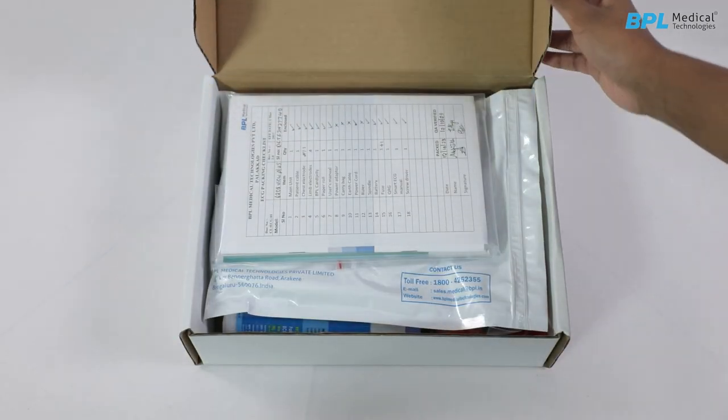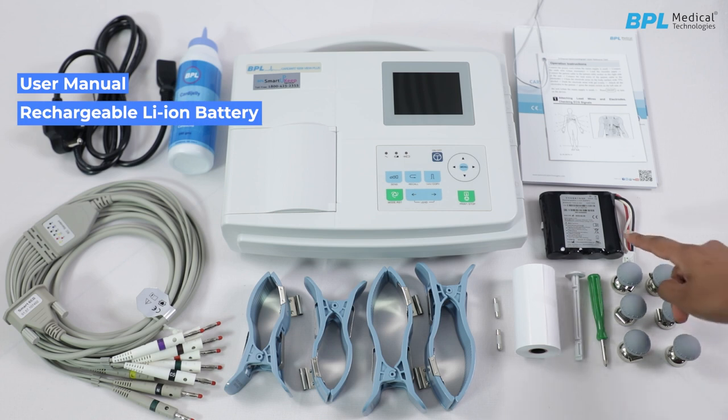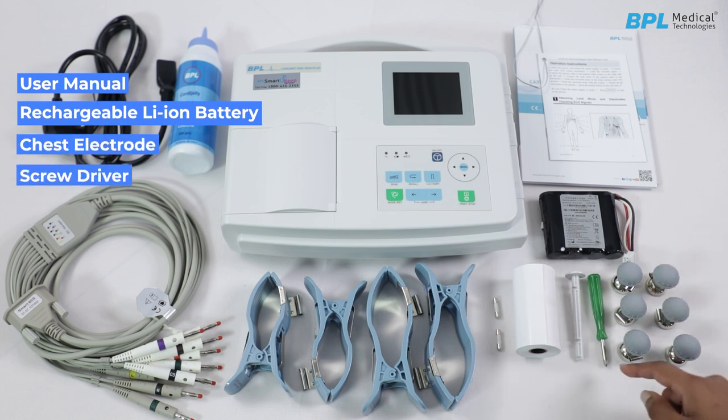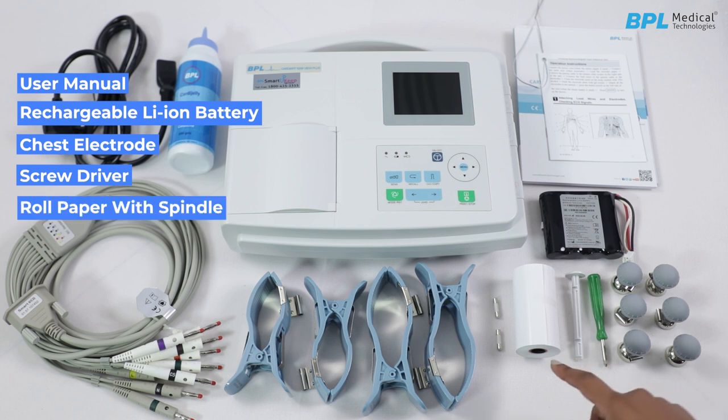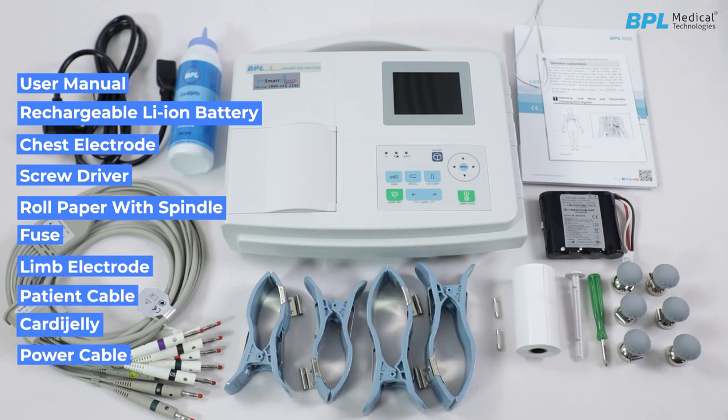The standard accessories provided with the machine include: user manual, rechargeable lithium-ion battery, chest electrode, screwdriver, roll paper with a spindle, fuse, limb electrodes, patient cable, cardiac jelly and a power cable.